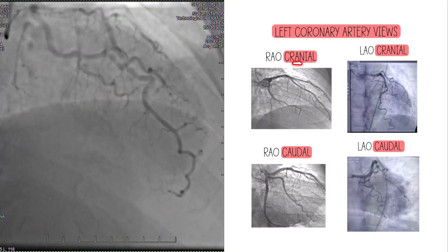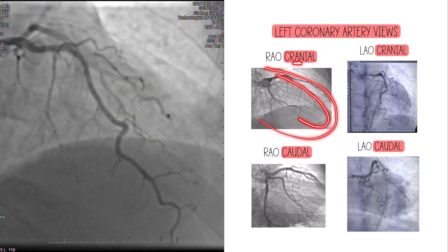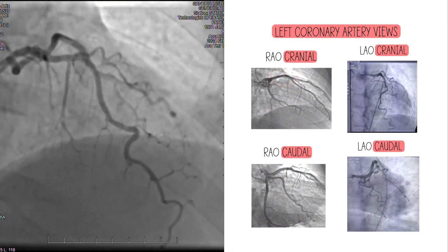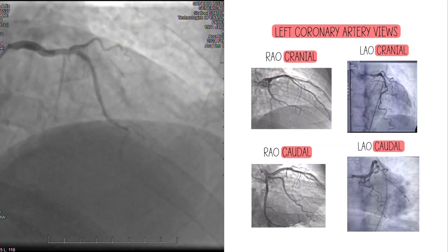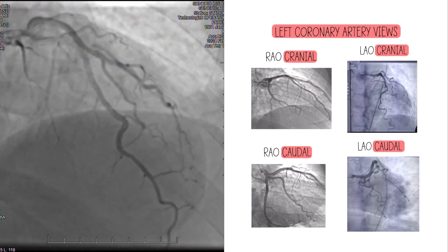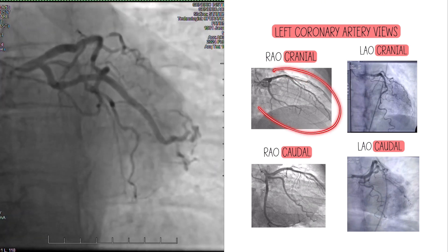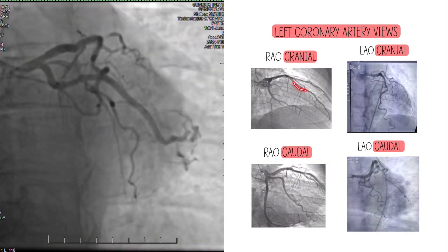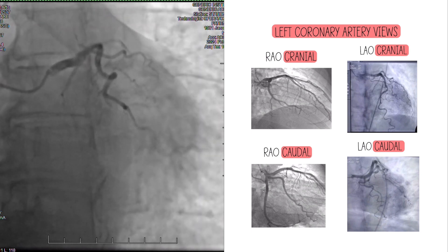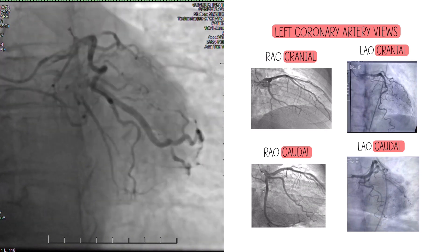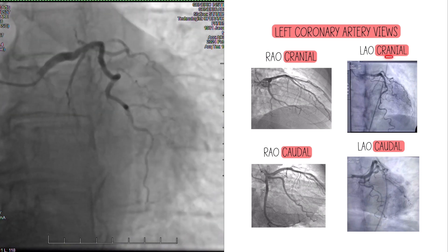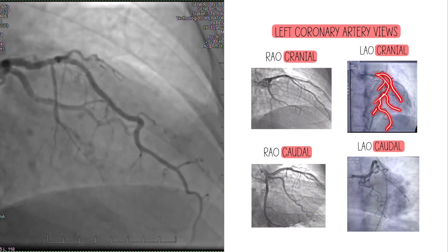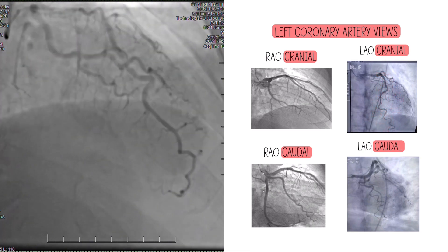In RAO cranial, since it's a cranial view, the LAD will be seen best. You can see the mid and distal LAD really well. You'll notice this proximal portion is overlapped with what we think is the diagonal. So if I showed you one view and said identify all of the vessels, you might not be able to — you might be able to say this is the LAD, but you can't really tell where the diagonal ostium is. So you'd go to a different view, like LAO cranial, where you can see the LAD really well and see where the diagonals take off versus where the septals take off. That's why we take multiple views — you can't see everything in one.